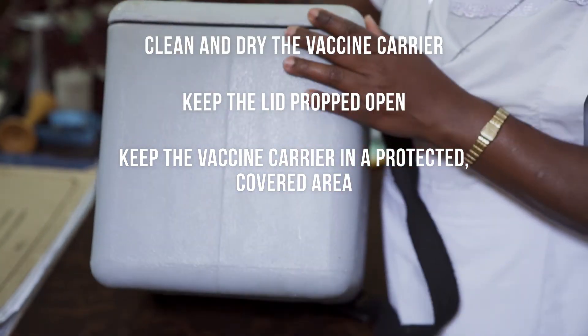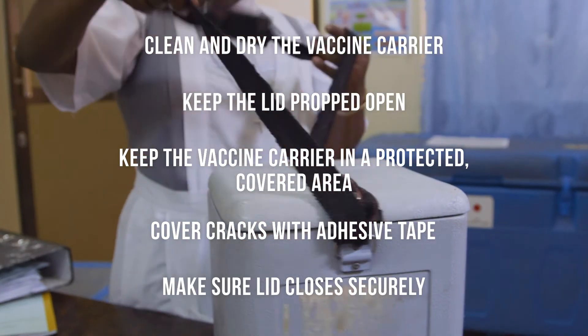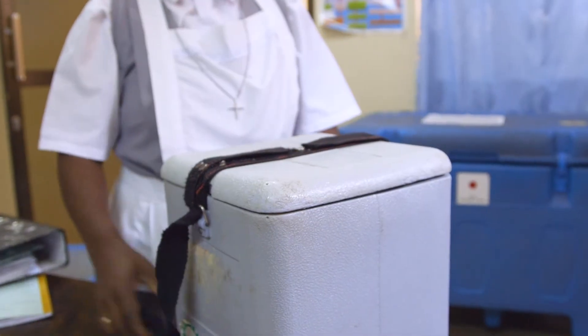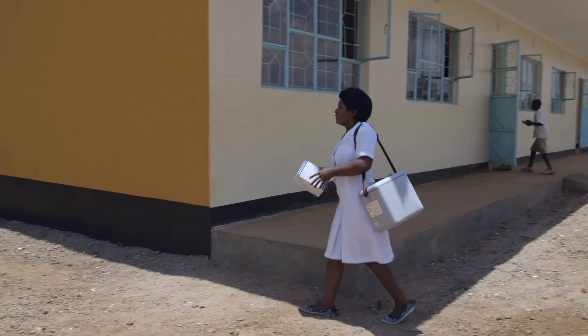If your vaccine carrier has a small crack, cover it with adhesive tape. Make sure the vaccine carrier lid closes securely. You should now know how to pack, use, and maintain your vaccine carrier.